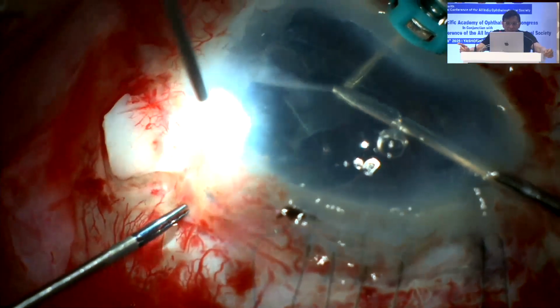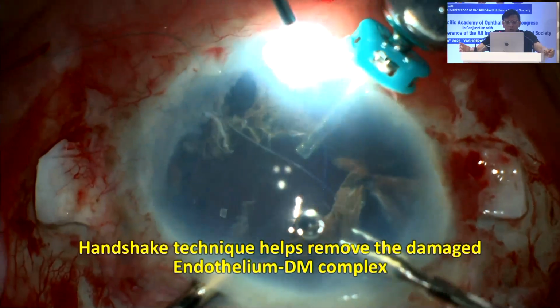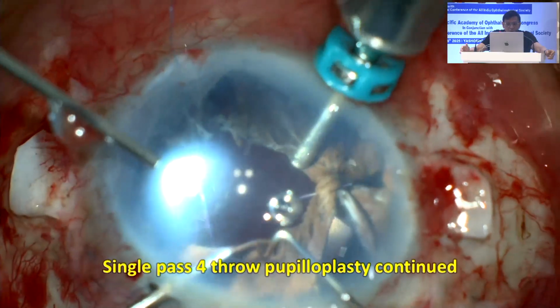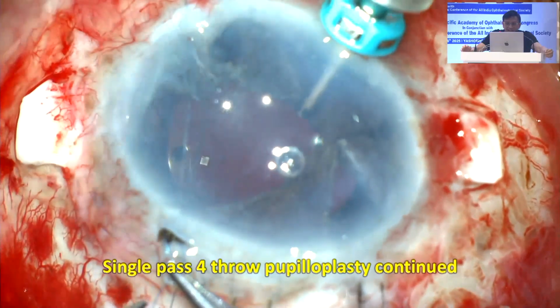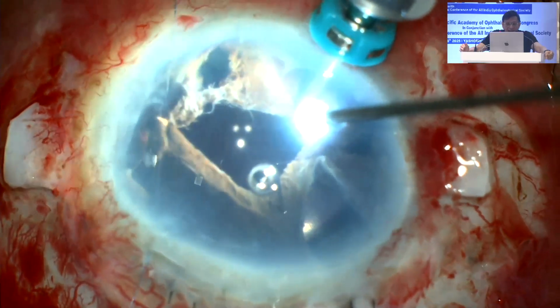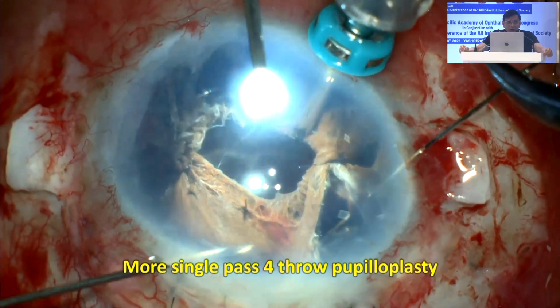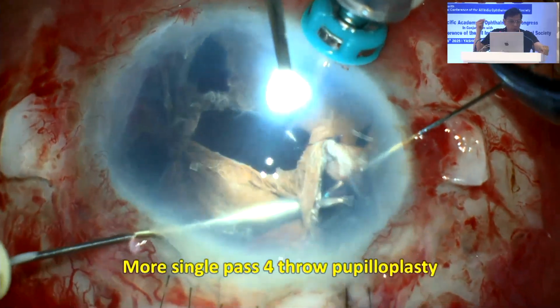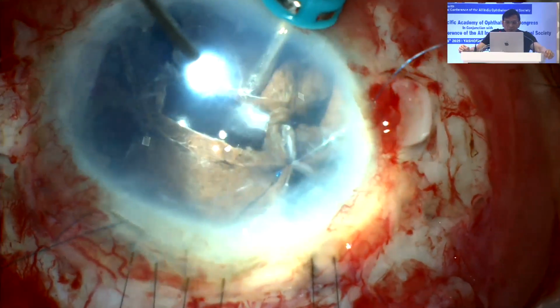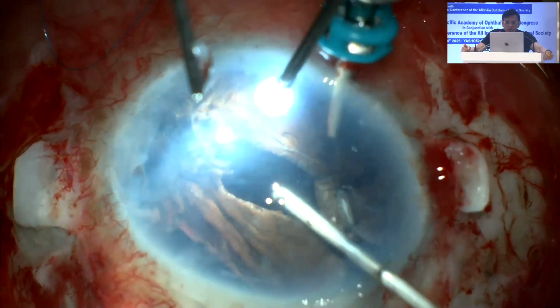See that trocar AC maintainer is there, which you are seeing with the blue coloration. So I've got a continuous flow of fluid inside the eye. Now I continue to do my four-throw pupilloplasty. It's quite badly traumatized, the iris, but please understand, as much as possible, try to repair it. Also look at the Purkinje image P1. That's what you've got to be concentrating on to see that it should be bang centered on the pupil as much as possible. So you see the Purkinje image, it's pretty good.